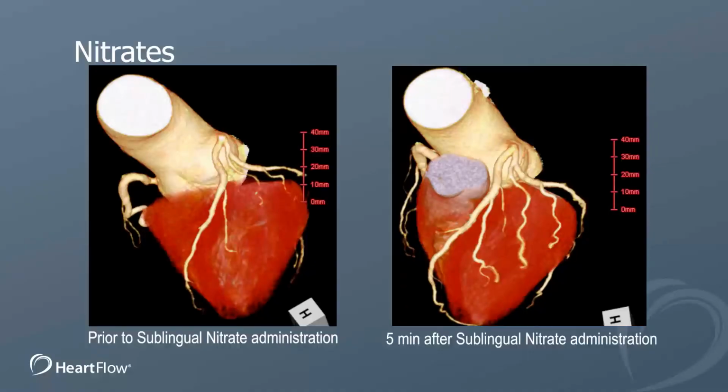In this case, we used weight-based intravenous lidocaine for suppression of PVCs, which the patient tolerated well. This slide is a representation of how much nitrates can impact the caliber of the vessels.